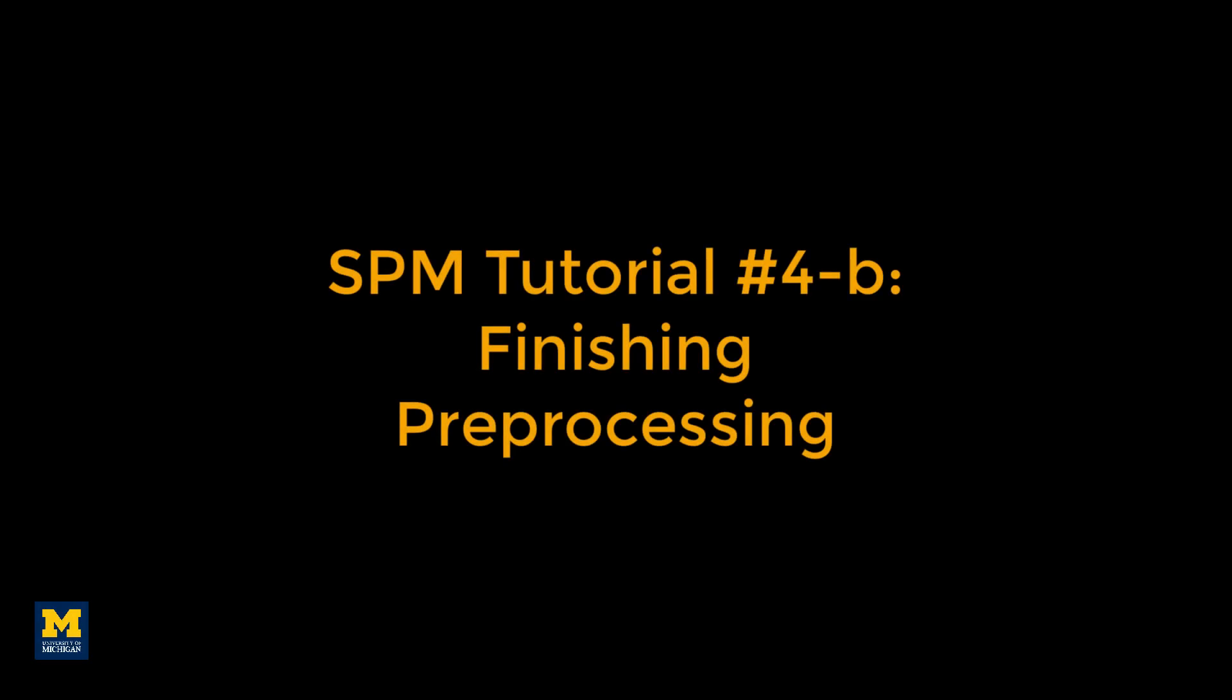In this video we will finish the preprocessing module by running all of the other steps, comparing the input and the output of each command to make sure that it ran successfully.